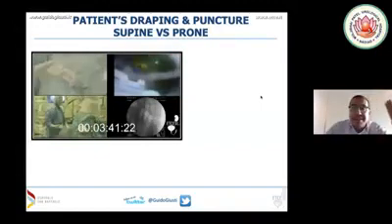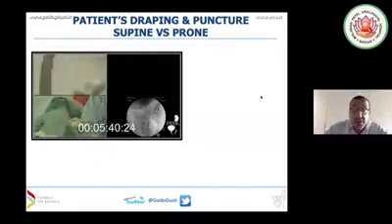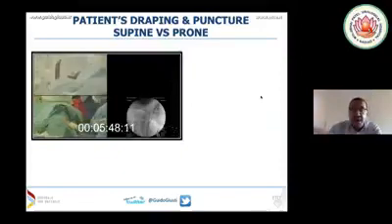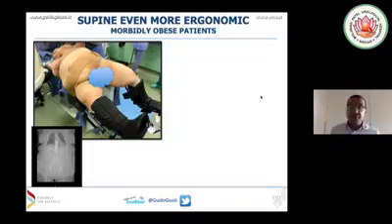So basically this is the step in which we save so much time, just because we drape the patient once and we don't flip the patient. So basically from the end of intubation till inside the kidney is more or less 10 minutes. And if it is an advantage for a normal patient, try to imagine for such a big patient like this lady. We are lucky enough not to have so many in Italy. This lady is my personal record.